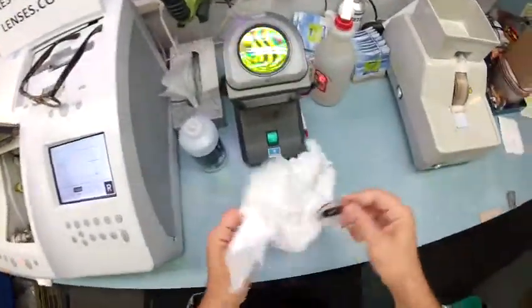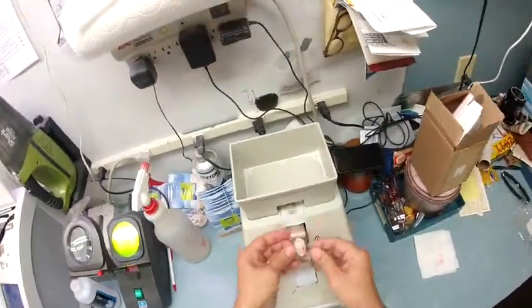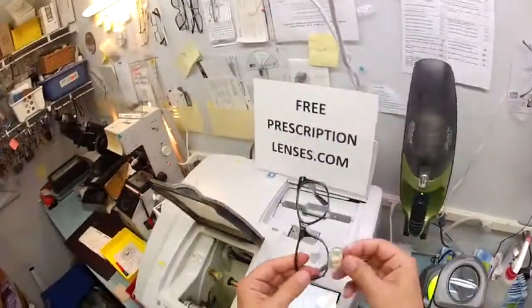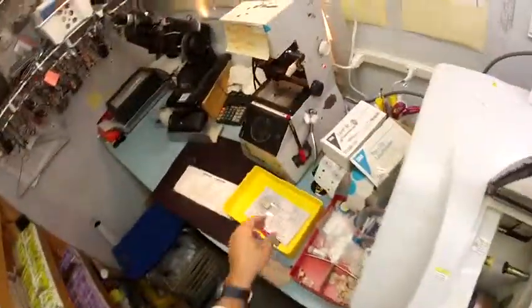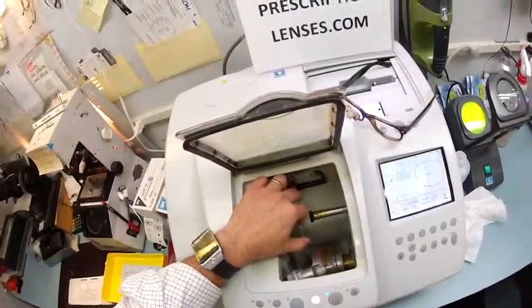So I'm going to take this out again, back to the hand stone for the safety bevel. Let me clean up my little workspace here. Clean everything around the circumference of your lens. And in order to mount them, I tuck it in at the corner closest to me, then using my thumbs I press down at the nose. It snaps in perfectly.